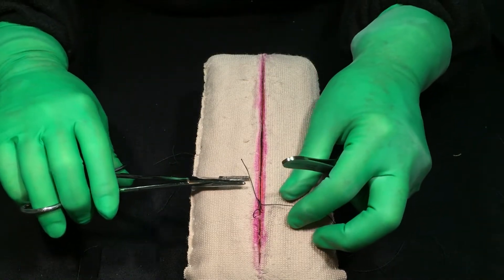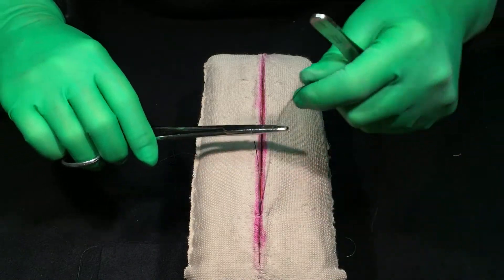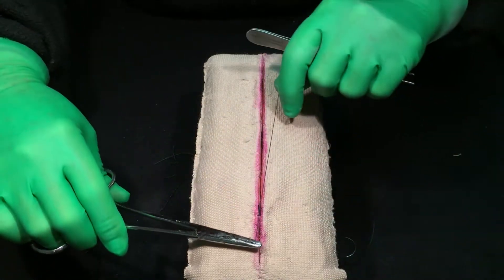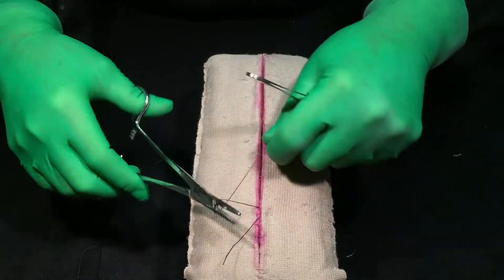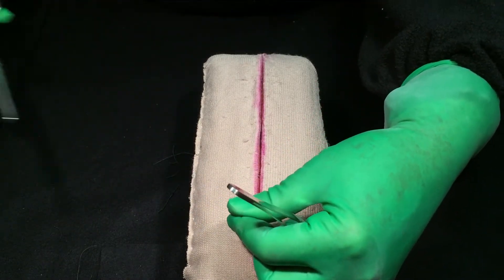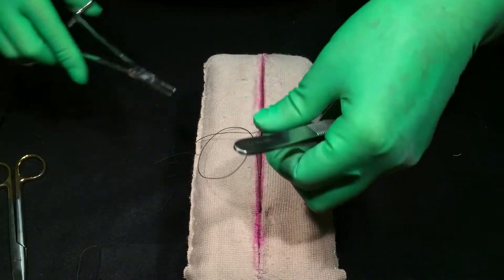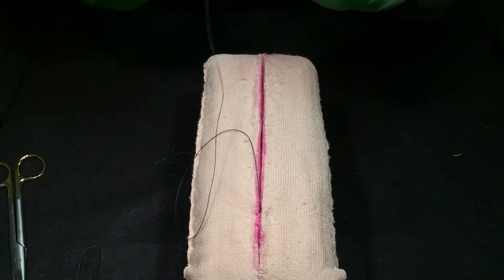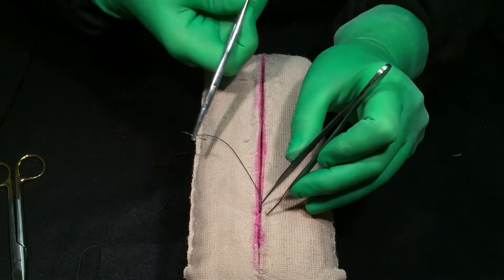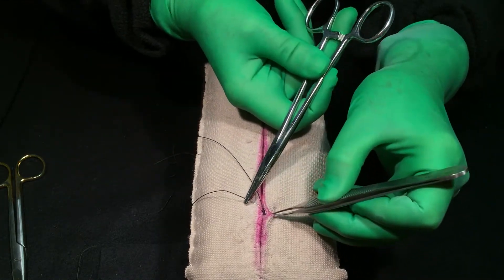On the running subcuticular, you're going to bury your knot as I showed you earlier to start it. When you tie, tie parallel with the incision to get it to come together nicely. I don't like how that knot is sticking up, so I'm going to go down deep and bury it.